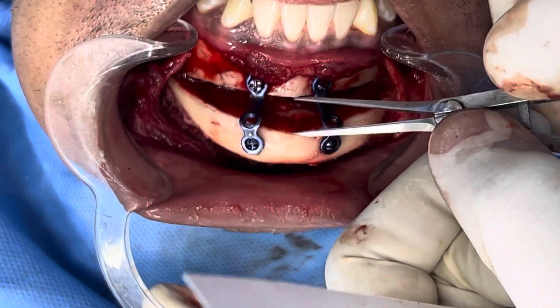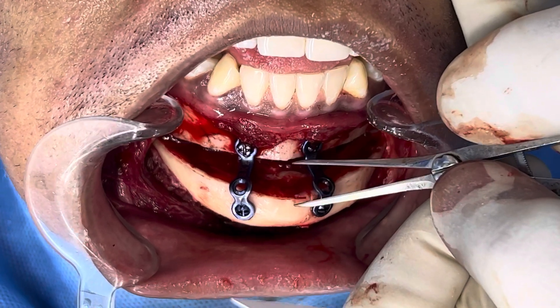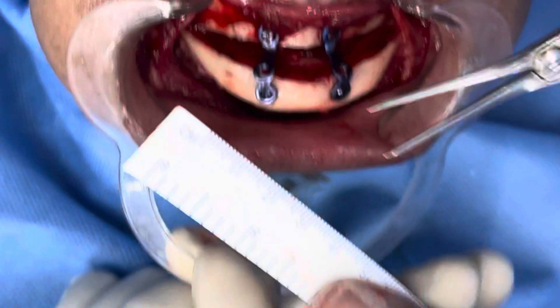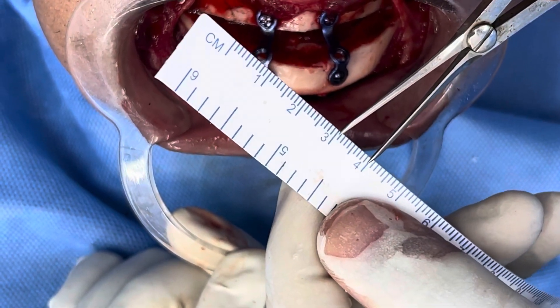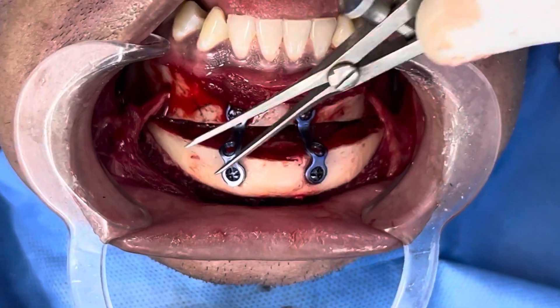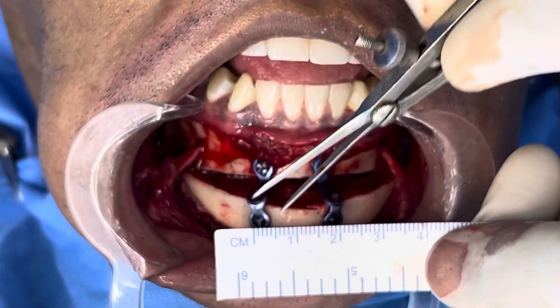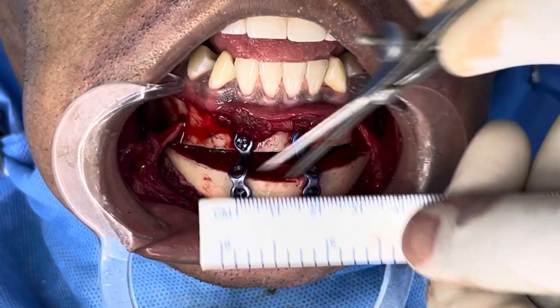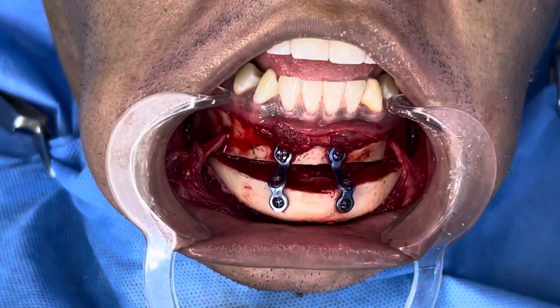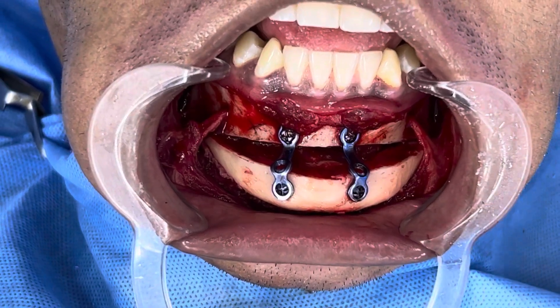This is a male genioplasty, so the patient desired a much stronger, broader chin. That translates to ten, ten, and five millimeters. You can see we've done some sculpting and contouring here — this is the broad part of the chin that's now visible, and that's more than two and a half centimeters. So it's got a much broader and much more projected chin, and the lower third of the face is being made more proportional as well.